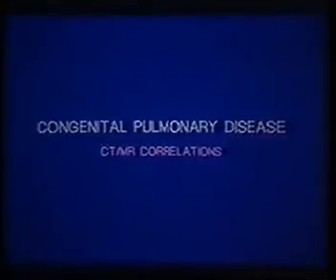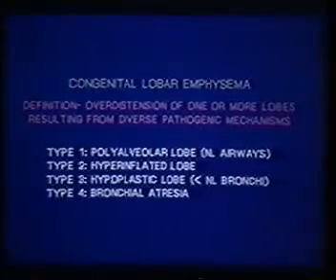as I'll show you throughout the course of this lecture, since so many of these entities are associated either with abnormal vessels or with abnormalities involving fluid collections. Those are two areas in which MR is particularly helpful and particularly accurate in delineating the extent of disease. Now, what constitutes this spectrum? Well, there are a number of disease entities, and we'll go through these sequentially.